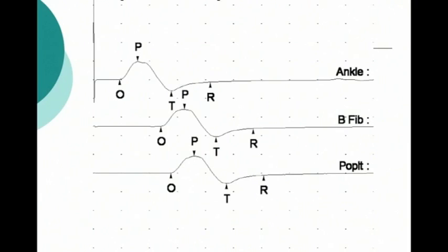Now here's another interesting picture. This is the peroneal nerve. Again, as I said before, in some nerves you stimulate in 2 places, some nerves you stimulate in 3 places. The nerves that you stimulate in 3 places, you usually do so because they can get entrapped at one of these 3 places. Peroneal nerve is one of them. The ulnar nerve is another one, as we will see.